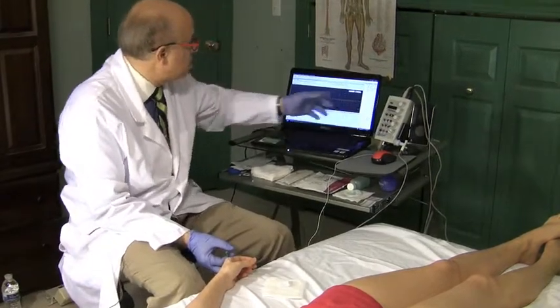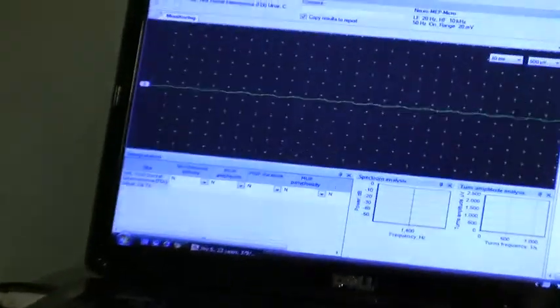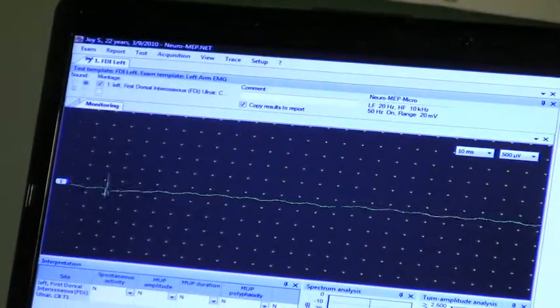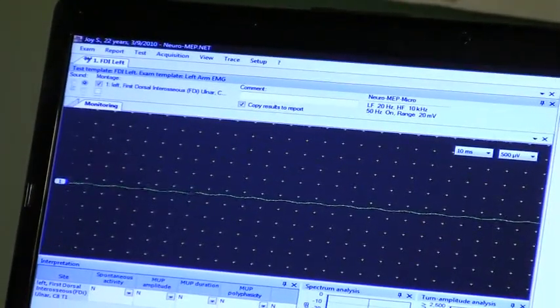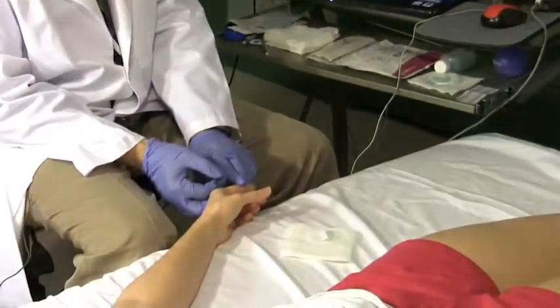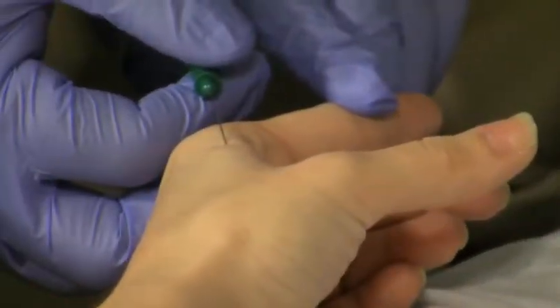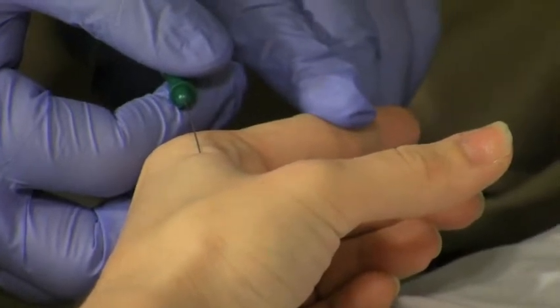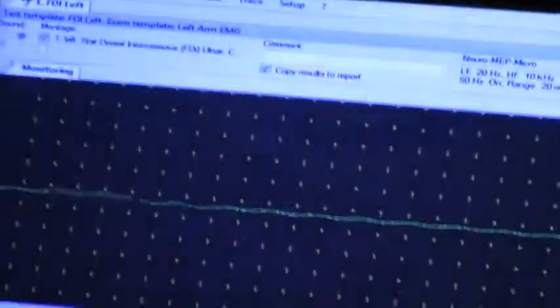And you see that the muscle is not moving. So we have a flat line. So now I'm going to show you that we are in the muscle. Raise this finger up gently. Raise it up. Keep it up. You see now I'm inside the muscle. These are motor units. But I don't want to just show you motor units. I just want to show you that I'm inside the muscle.